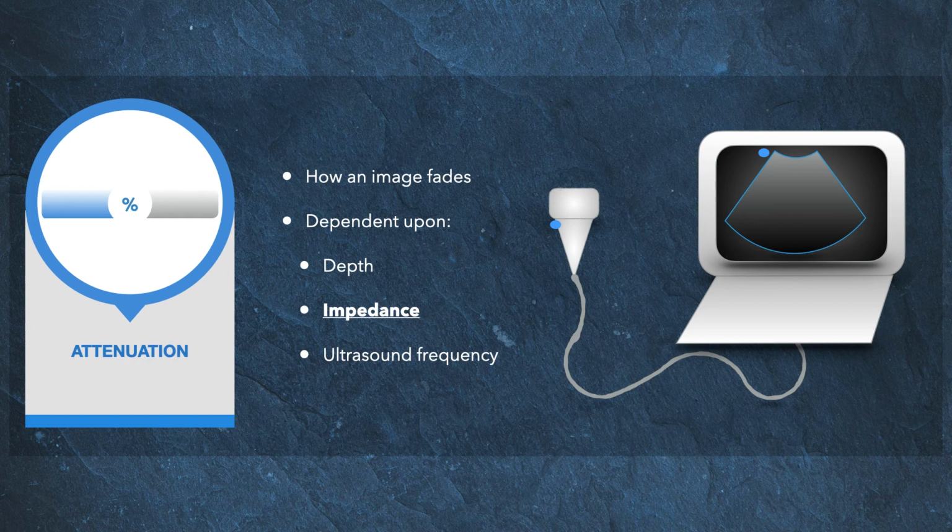This is one reason why the ultrasound machine not only has different transducers with frequency ranges, but it also has specific settings for different examinations. A really smart physicist studied the average impedances of different tissue types and anatomic locations and made adjustments to each setting to optimize visualization of that tissue. This is why you should use the cardiac setting for echocardiography and the abdominal setting for abdominal images. Once you have more experience, you can manually adjust the frequency for your imaging, but for now, just use the presets in the machine.